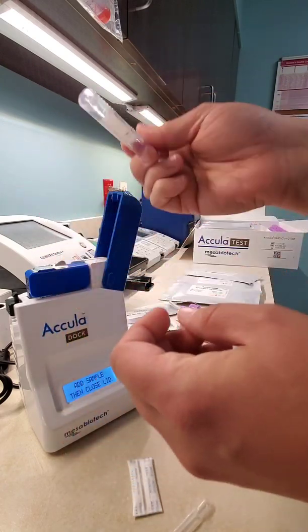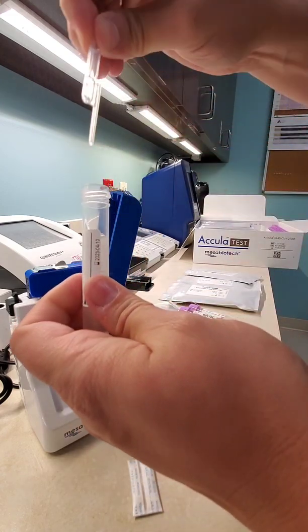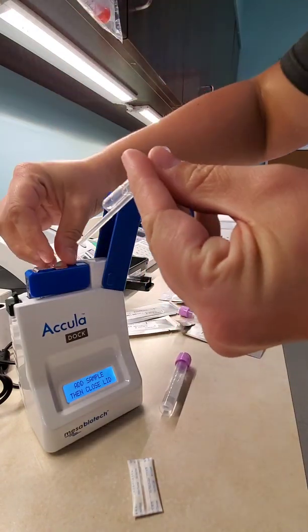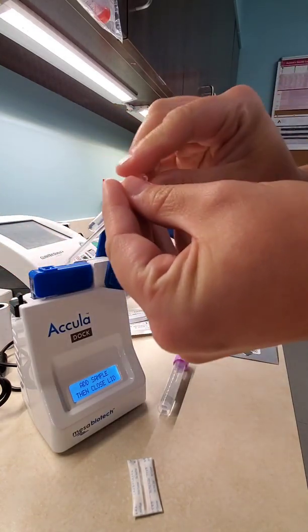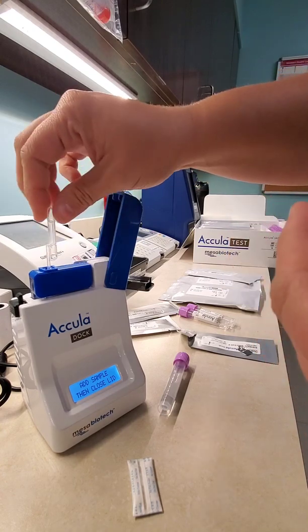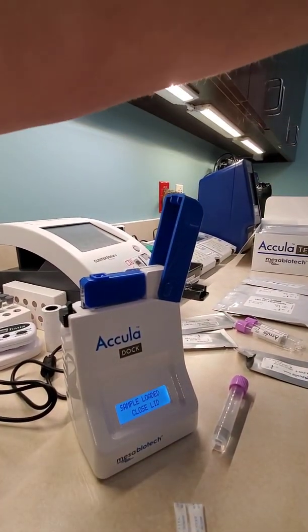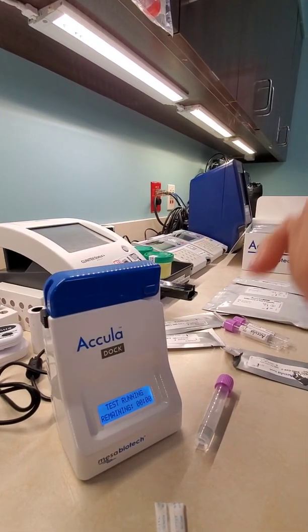I've got my sample here, inverted a couple of times. We'll open it back up, get our small transfer pipette, stick it in, do one squeeze, and draw your solution up. Recap it. After this seal is broken here, you have five minutes to add your sample, so just try to do it as quickly as you can. Then you will put your sample inside — you'll feel resistance — and then squeeze just this bulb, not this bulb. It says 'sample loaded, close lid.' So we'll take this out, discard, and then close the lid.